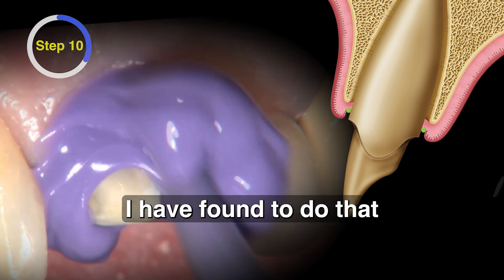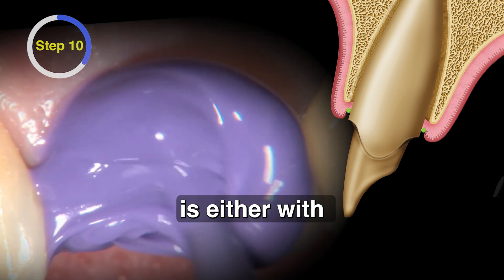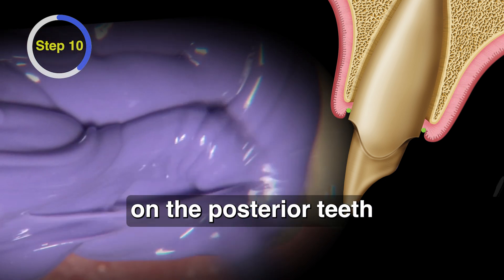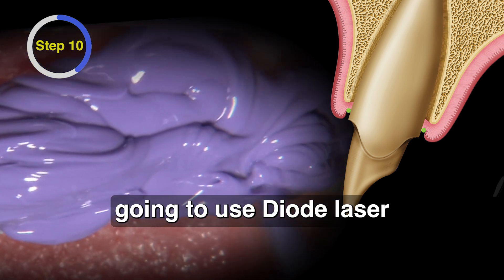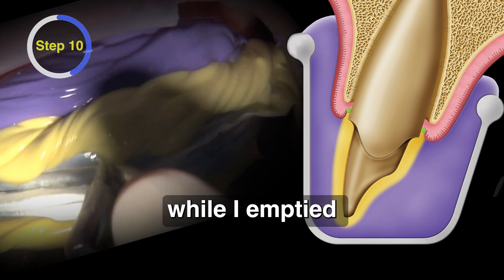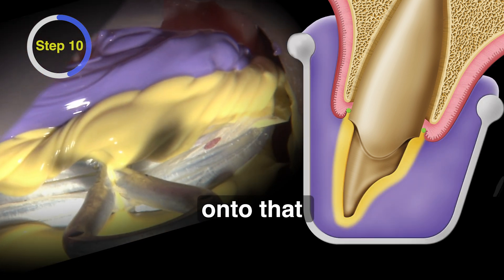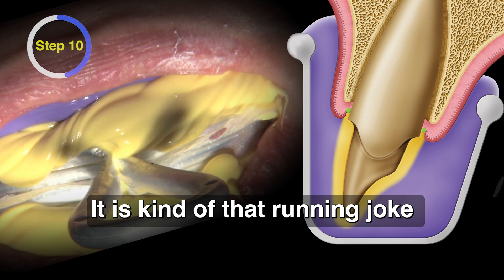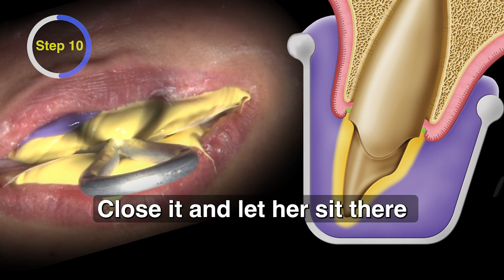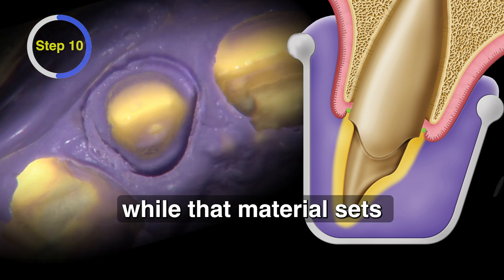The only way I have found to do that is either with the two-cord technique or a diode laser. I'm happy to use a diode laser on the posterior, but I'm not going to use one on the anterior. My assistant filled the double arch tray while I emptied the better part of a cartridge onto that one single prep — it's kind of a running joke I have with my assistant. Put it in the patient's mouth, close, and let them sit there for five minutes while that material sets.